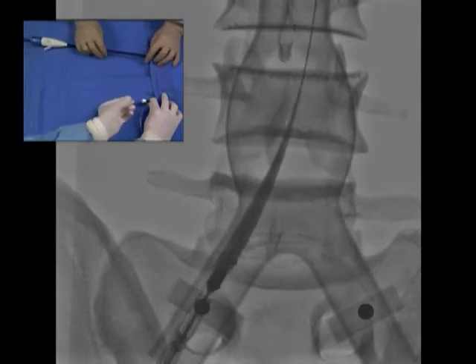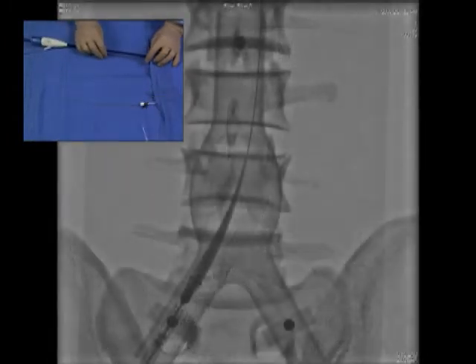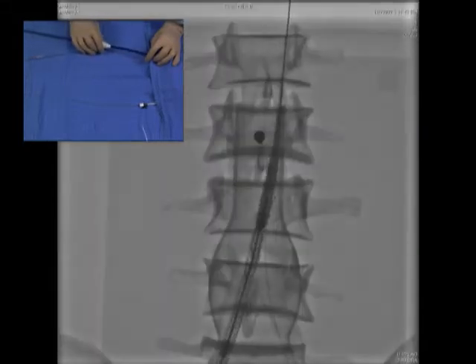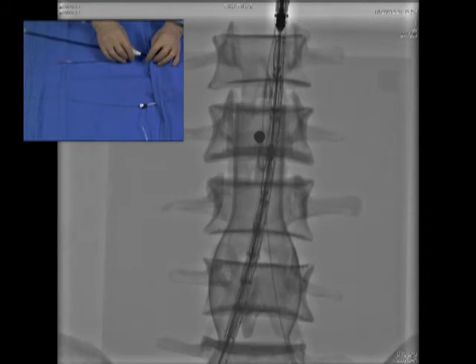Lock the C-arm and mark the aortic bifurcation on the fluoro screen as the delivery system advances through the ipsilateral common iliac artery. Stop when the radiopaque tip is just above the bifurcation and verify the orientation of the SurePass wire under fluoro. Continue advancement until the distal end of the stent is above the aortic bifurcation. Verify the contralateral limb orientation.